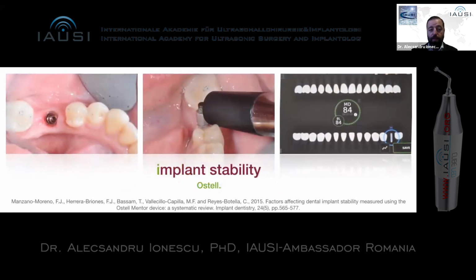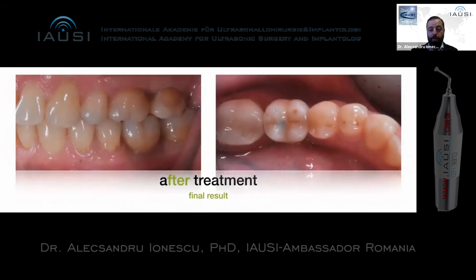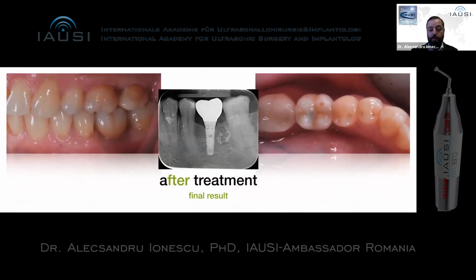And this is the stability of the implant with the Osstell measure, and this is the screw retained crown as the final result, and the X-ray of the screw retained crown.